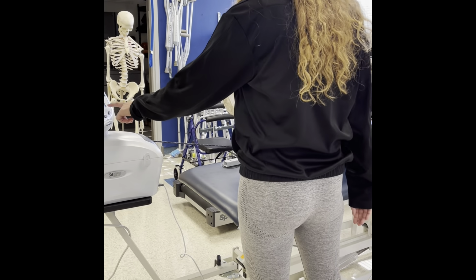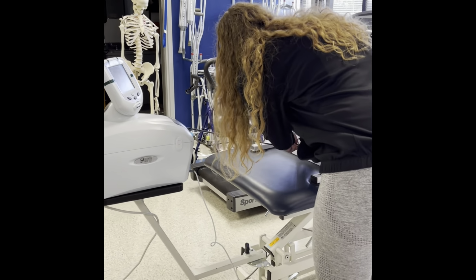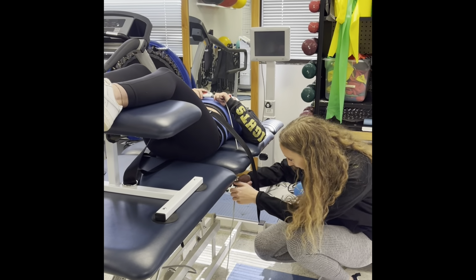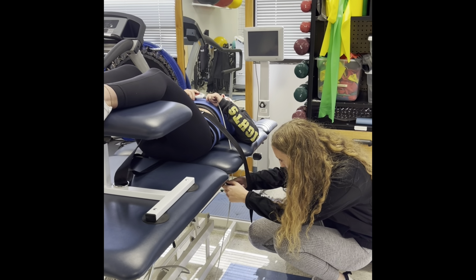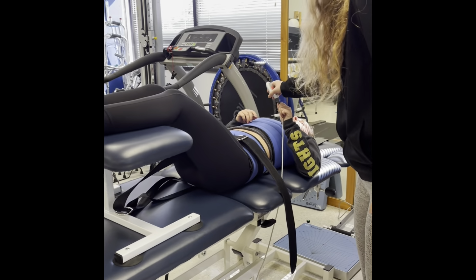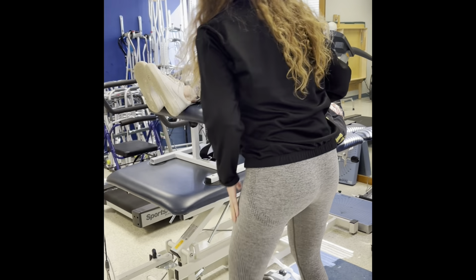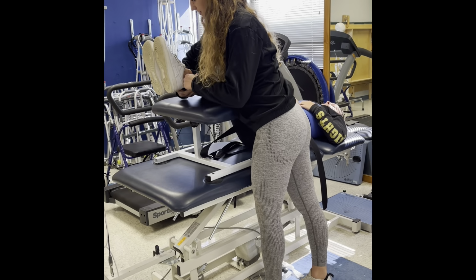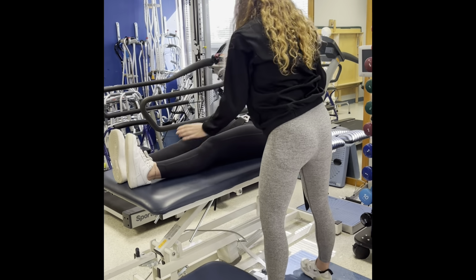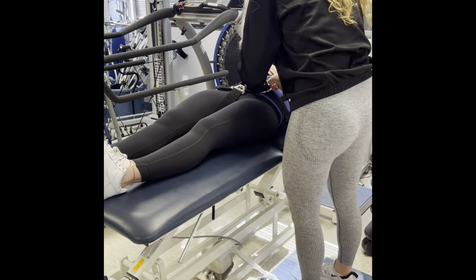Perfect. The first thing you're going to do is release the rope, just like that. Then you're going to make sure to lock the table again so that the patient doesn't move around. Just like that. Then you can take the call switch back. I'll have you lift your legs up, like that. You can come over here if you can't see.